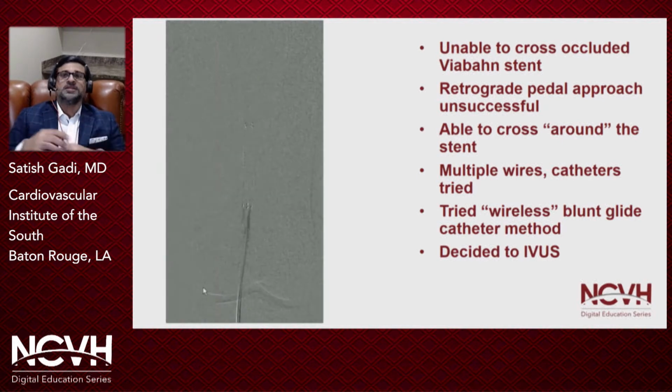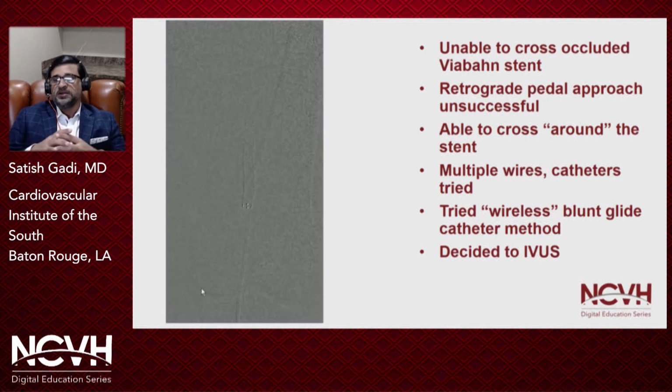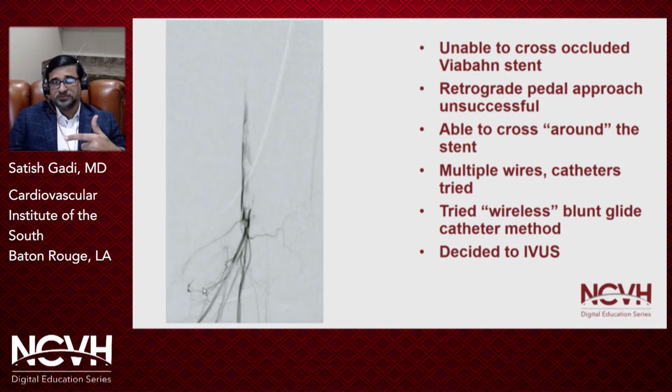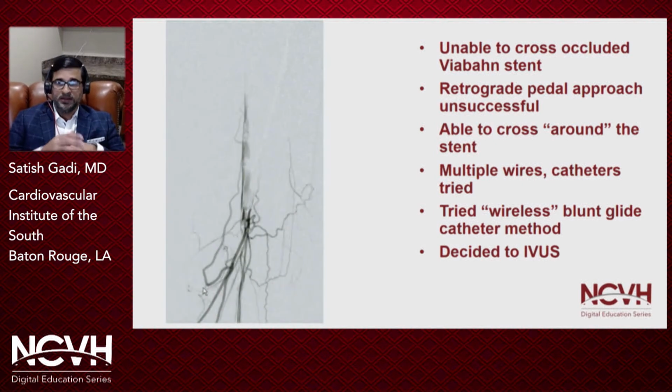But I just couldn't get in the stent. And again, oblique views were extremely helpful. It looked like I was through the stent. When you went oblique, you then realized you were actually behind the stent and around the stent, not inside.